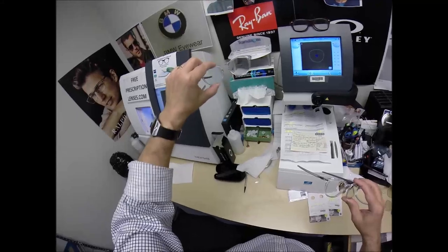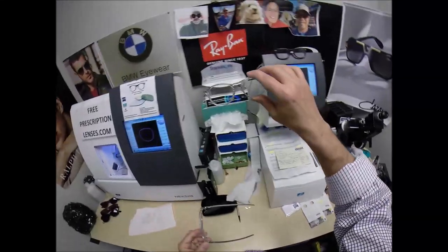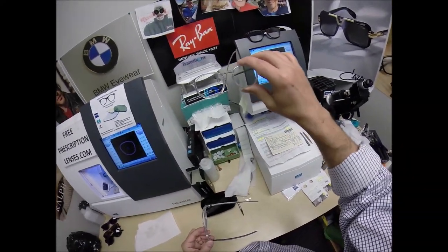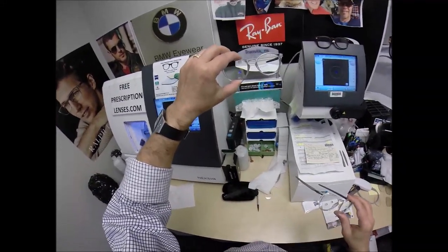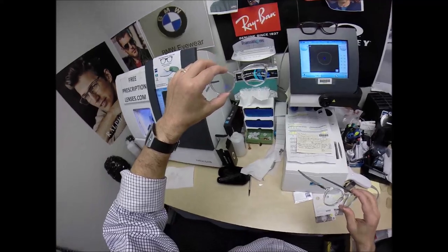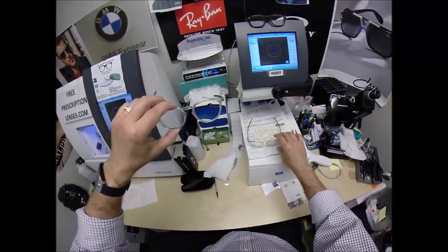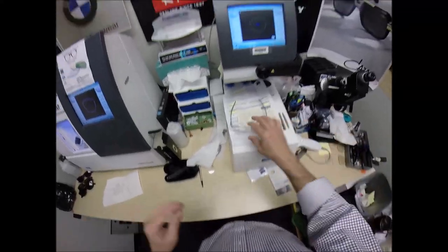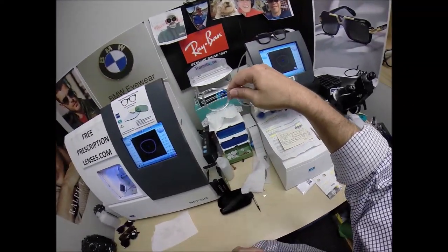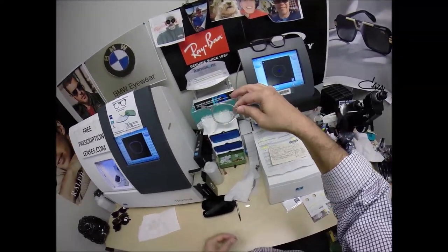His natural eyes are these. Mine are about this. So my eyeballs are in his lenses, and his eyeballs are in my lenses without wearing anything. Does that make sense? His natural prescription. So for me to see like Robert does with no glasses on, I have to put mine on. For him to see like I do with no glasses on, he has to put his on.